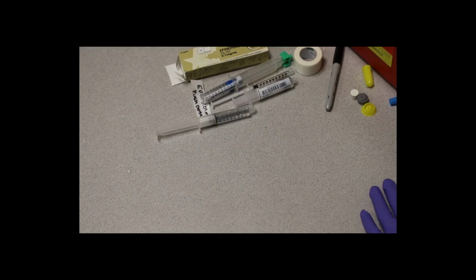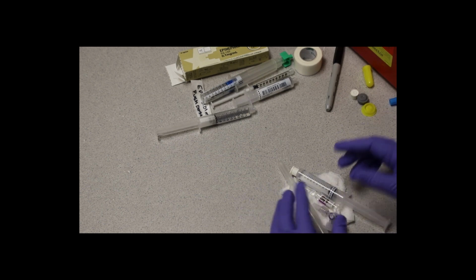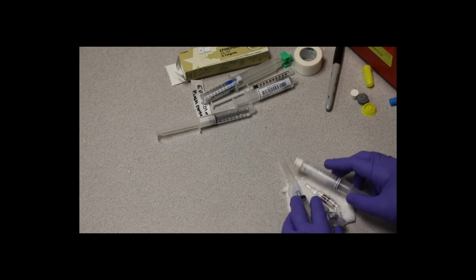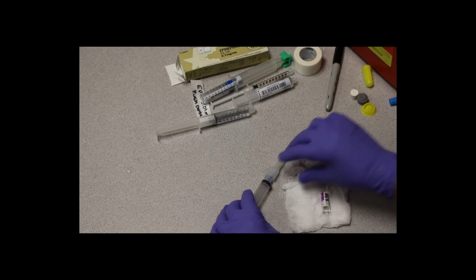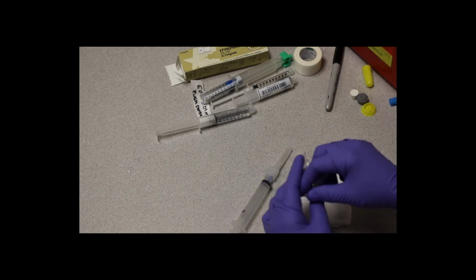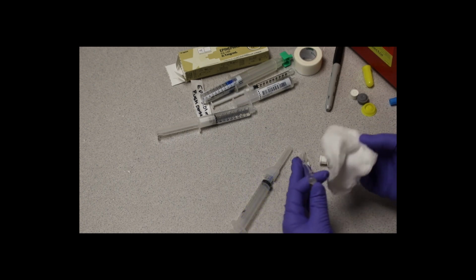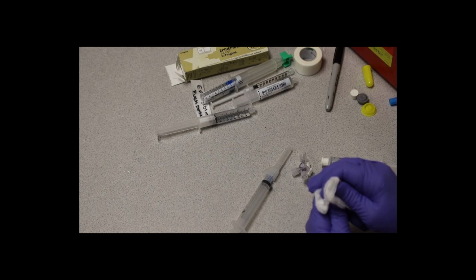What if, due to an epinephrine shortage, you are only carrying 1 milligram per ml epi? You'll know it better by its old labeling of 1 to 1,000. Then you would, of course, need to dilute this. And what if you don't have the syringe to syringe adapter? Well, then you can use a 3-way stopcock in the same manner.